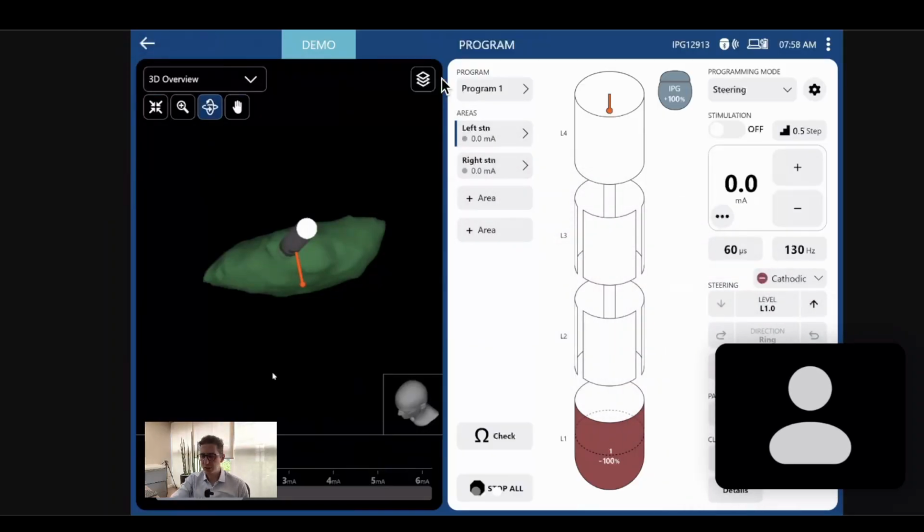If you remember in the hotspot class, the very good position in the STN is on average here. So in the dorsal lateral posterior part of the STN. So here, if you split the STN in three, here in this third, in the division between this third and this one, we are going to see the hotspot. That's the best region where you can elicit more improvement in Parkinson's.